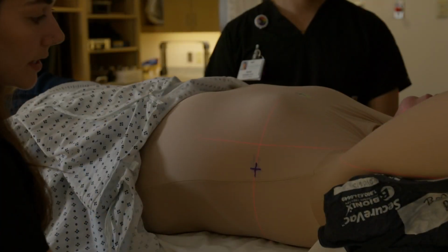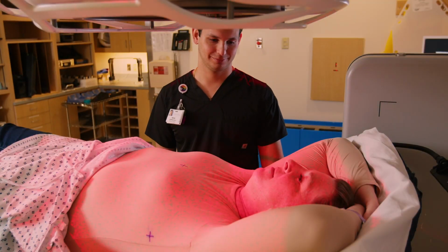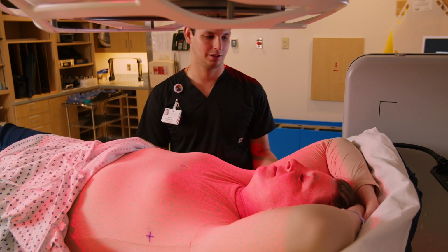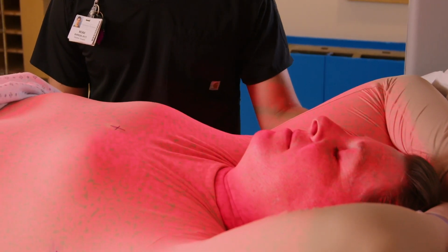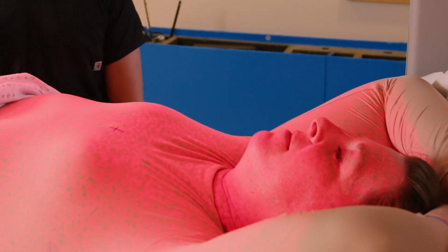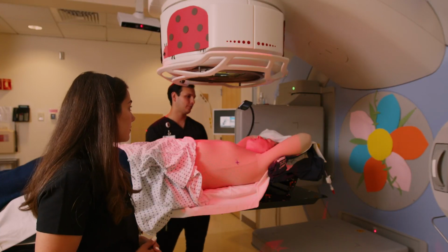on your skin. The therapist will turn on a software system called Vision RT, which will project a bright red light onto your skin. There is no radiation with the Vision RT red light system, and it is safe to look at. This system is used to fine-tune your position by tracking your skin surface. Vision RT is a very important part of your setup and helps the therapist to know when your breath hold is in range for treatment.